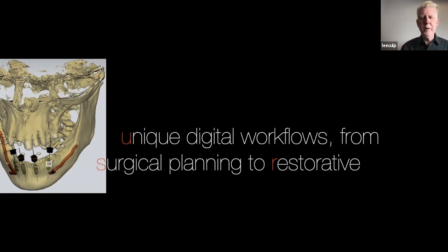attach your scans. But we've still done CR cases where none of the teeth are really touching except maybe for one molar, and still are able to scan that and scan a bite and have that repeatable on an articulator and on the digital articulator. But if you got to go too far, then just put some bite material in there and open them up and scan your bite, and you'll have that bridge between the upper and lower.